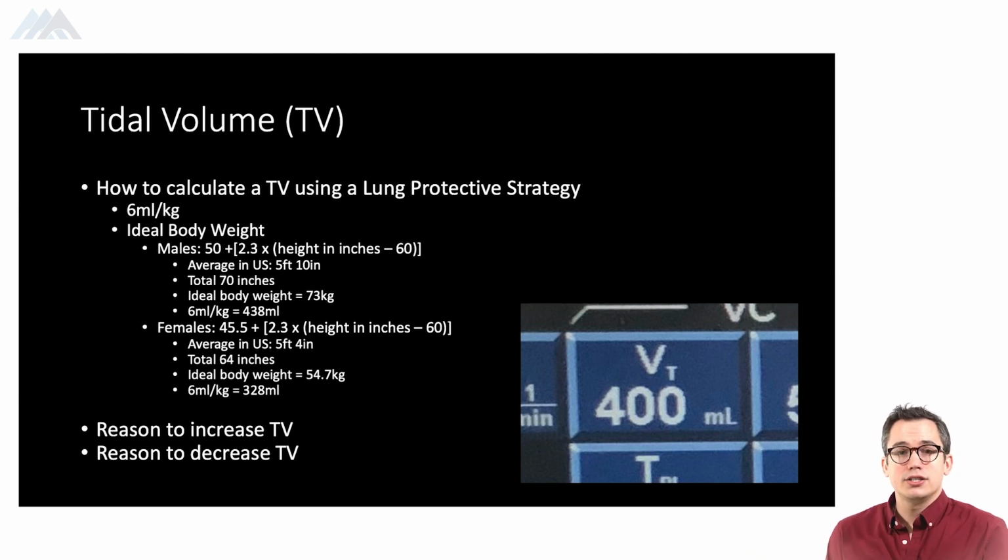If maybe that initial setting is dropping your CO2 too much and now we need to increase that number, we're just going to decrease the volume that we're putting into the lungs. So if our CO2 is too low, we can decrease our tidal volume. That then will be a smaller breath that we're taking and a smaller breath then that we're exhaling. If we're exhaling less CO2, then that means that we'll have more CO2 within our body.